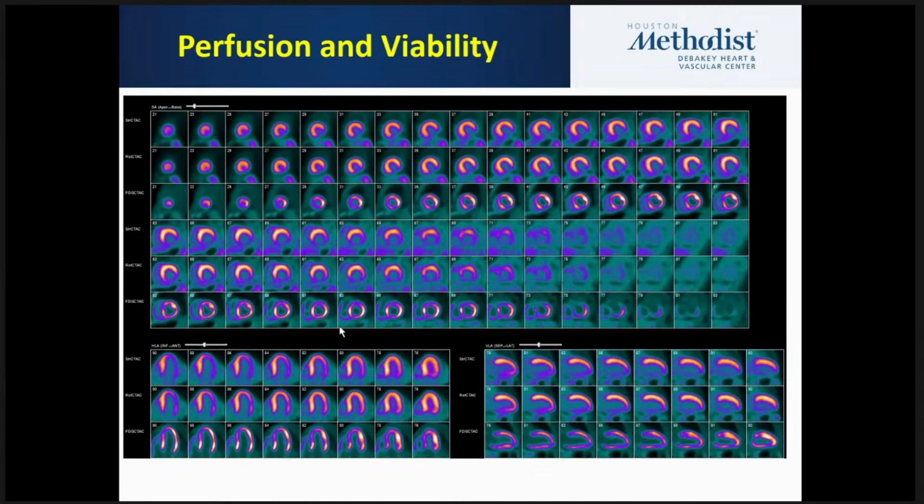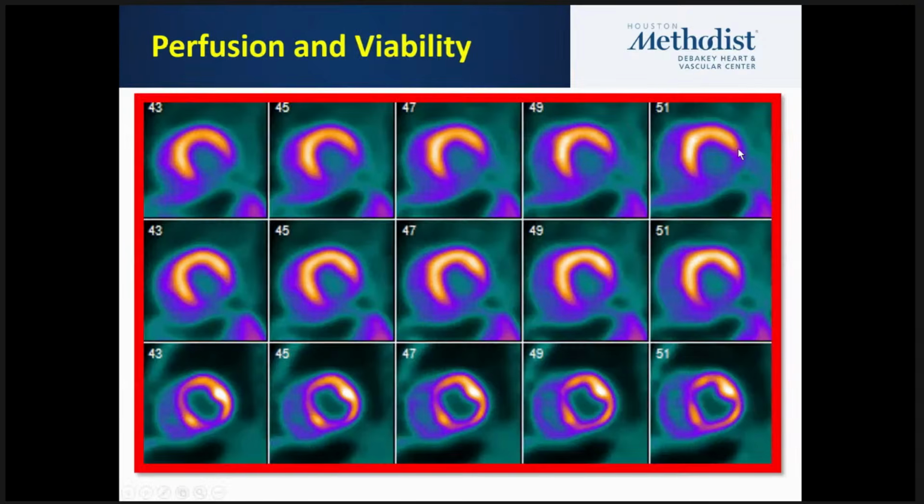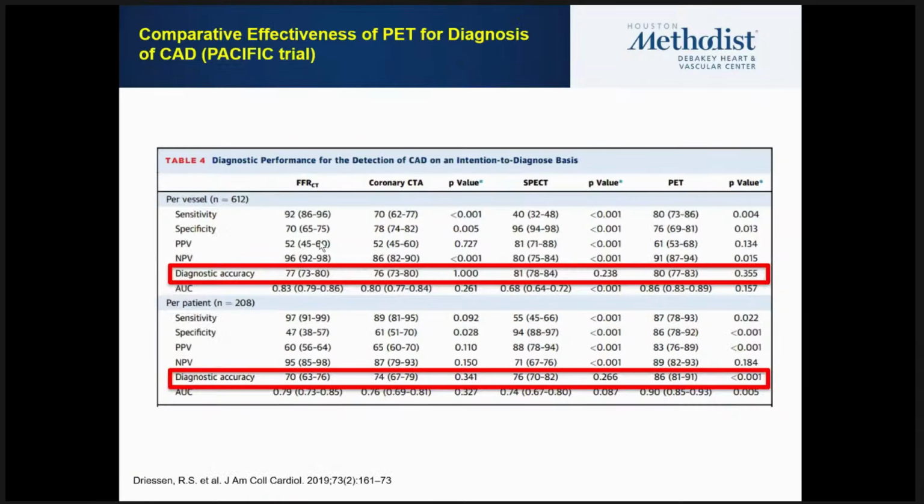And if I zoom on these images, now you can clearly see that there's a dense perfusion defect at stress and at rest, which looks minimally reversible. But now you can see almost normal uptake in the inferior inferolateral wall, just a minimal decrease in count. And this is a clearly viable segment that the patient would benefit from revascularizing the circ or RCA.